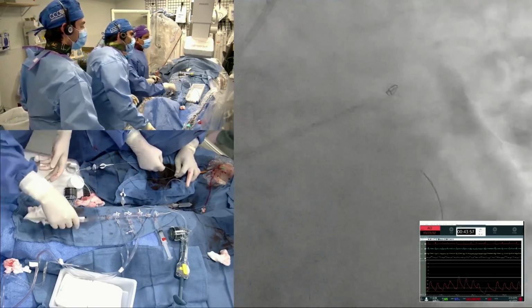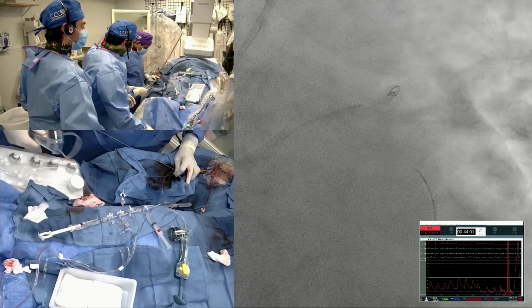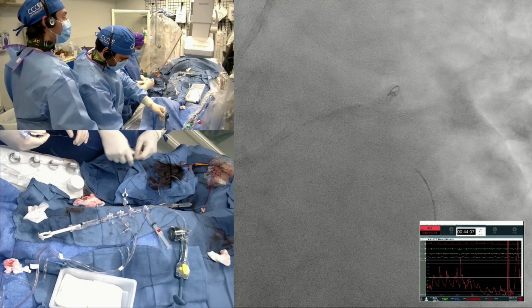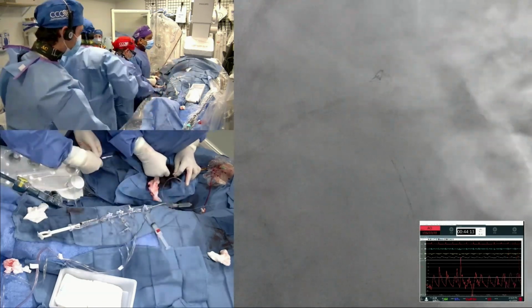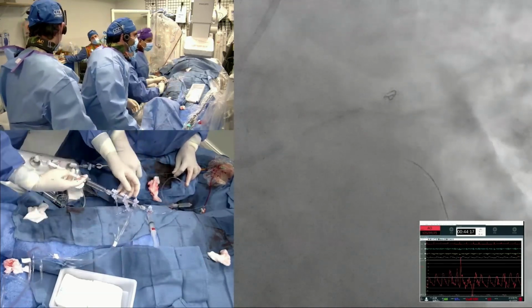I mean, I'd say that there's no downside. I would have done the IVL and then do the IVUS. Maybe. I mean, I would have skipped that. It was pretty clear. If you want to achieve a really 4 plus diameter here, it's one thing to do rotablator if the reference diameter is 3 or 2.75, and a different thing if it's 4 plus. I think you really need the bigger attempt for that.